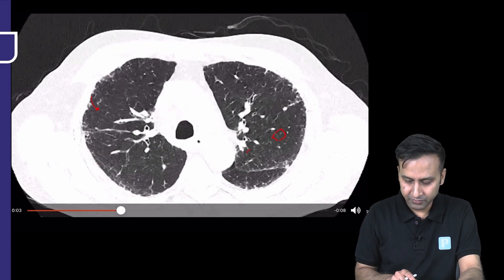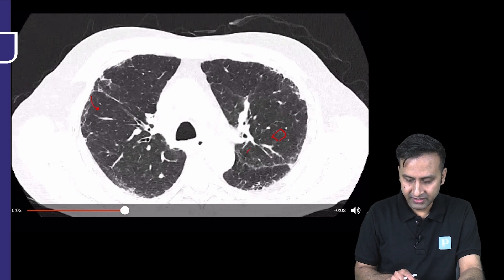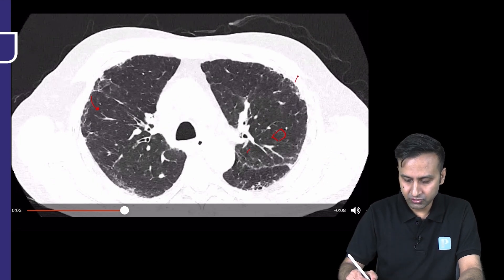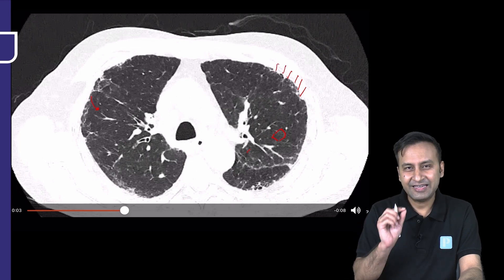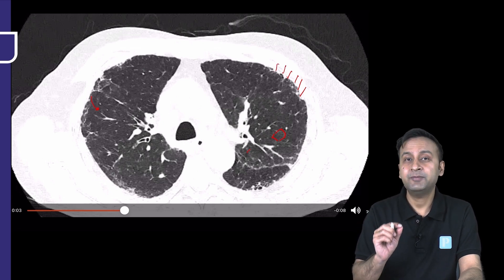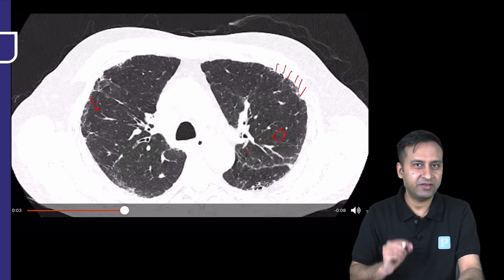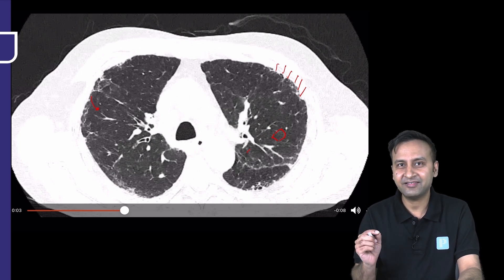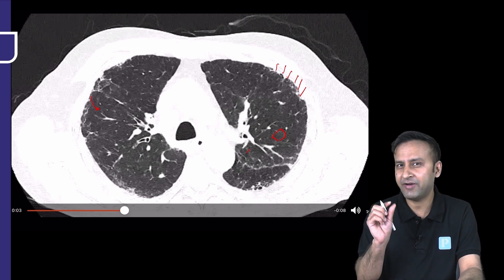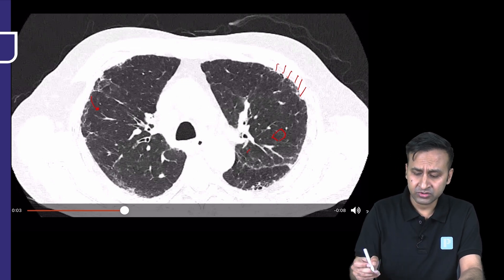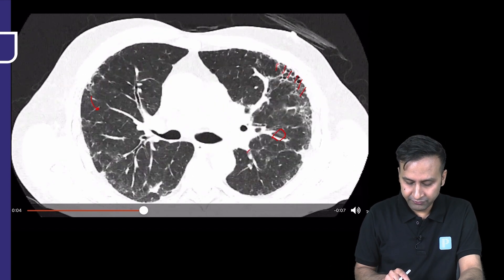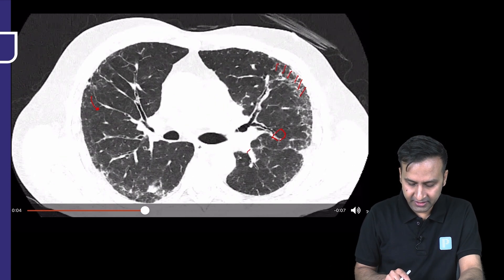As we go down, we can see something else. We already looked at the interlobular septal thickening. Now I want you to look here — there is a fine, lace-like, net-like appearance of reticular opacities in this area. Because these are linear reticular opacities in a lace-like fashion, very fine and very small, this is intralobular septal thickening.